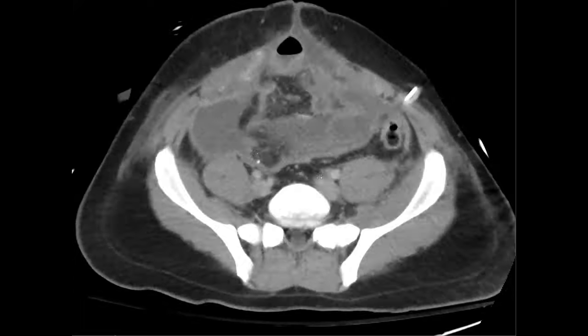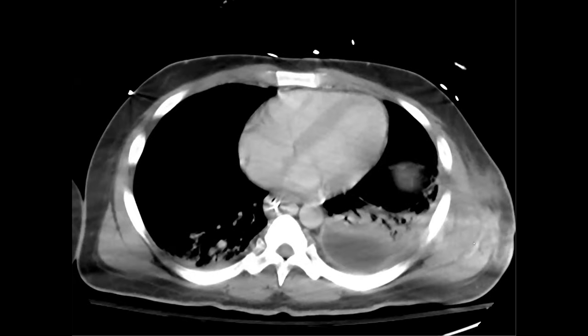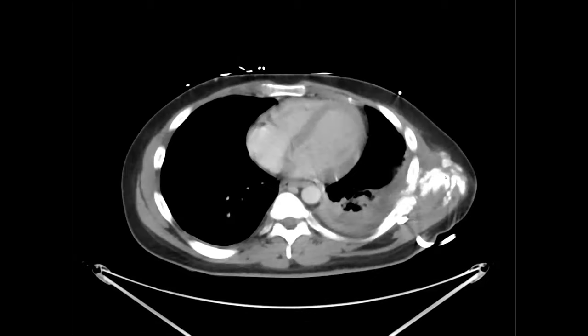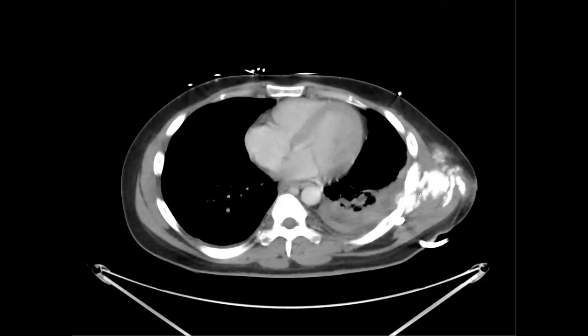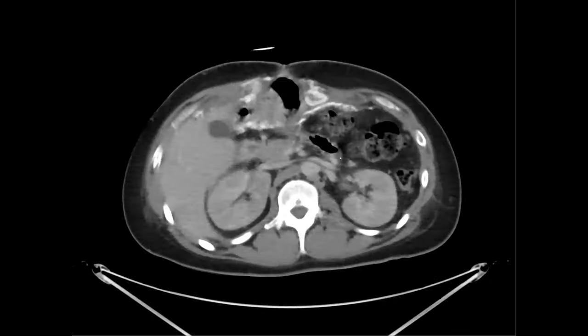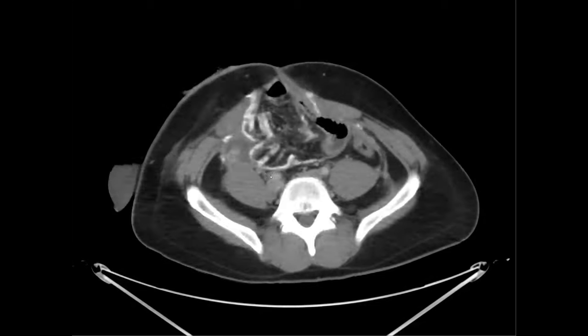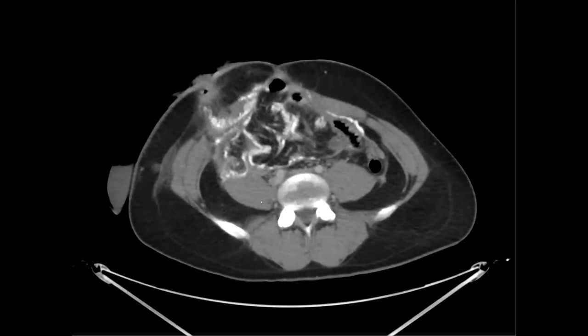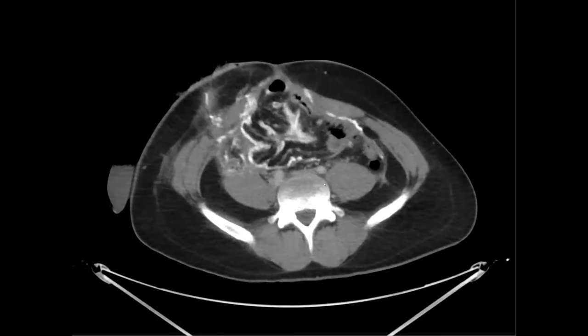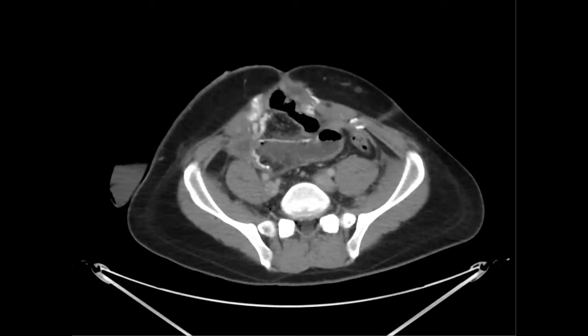Mm-hmm. And then also they had a hematoma in their chest wall. The hematoma over here had maybe just some faint calcification. And by the time we were doing our exam, there was a lot of dystrophic calcification here. So I just thought it was interesting. It was basically dystrophic healing calcification that was laid down in this hematoma pretty rapidly, but also within the peritoneal cavity, just within a couple of weeks. I haven't seen something like this that rapid. Yeah, I've never seen it like this. I looked at the patient's calcium level and it was normal. Their phosphorus was a little abnormal, but I was wondering if maybe this was metastatic calcification.